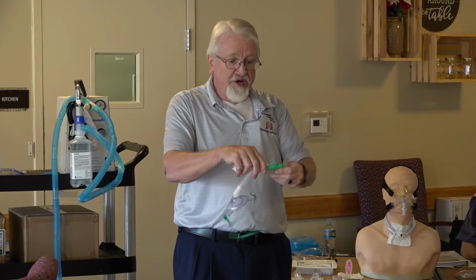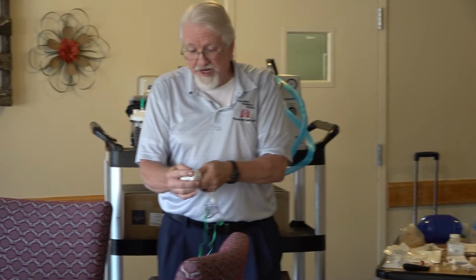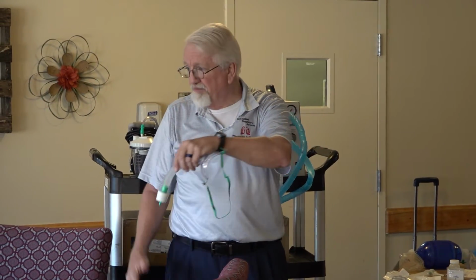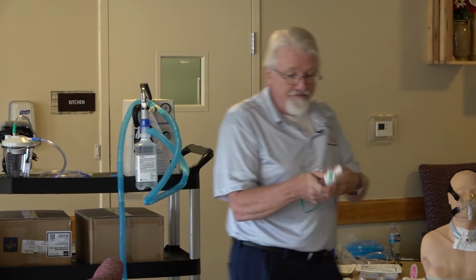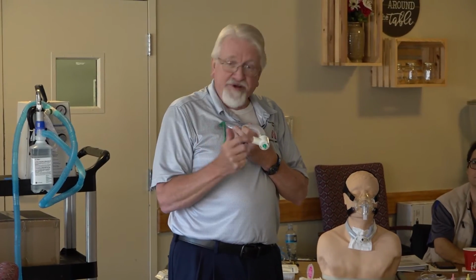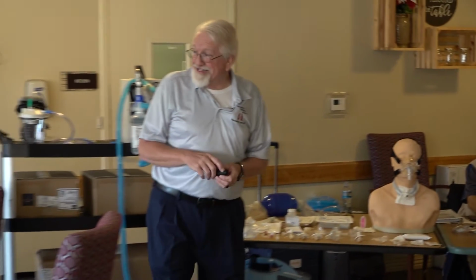Right? Because I'm not entraining anything. I've got everything covered up. My pillow, my blanket, my whatever. So this is basically a protection device to keep your ports where you're entraining from getting stopped up or covered up. So always make sure this is out in the open if you have a trach patient or whoever. If they're wearing a Venturi that has this, it's not where you give a nebulizer treatment. All right? Okay. Any questions about any of that stuff?